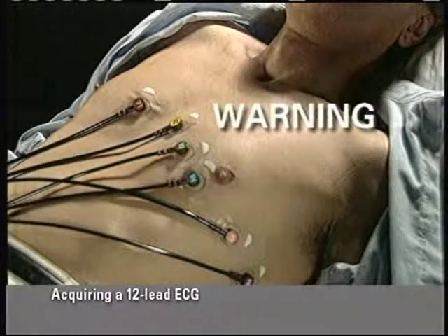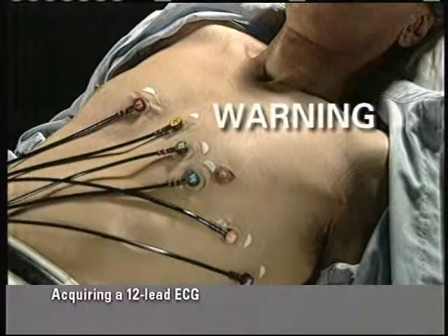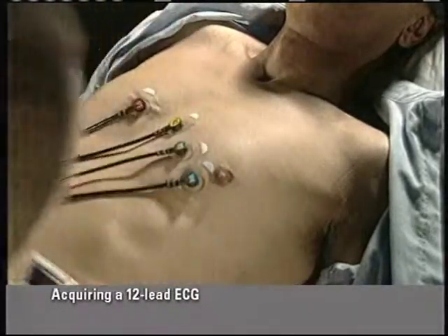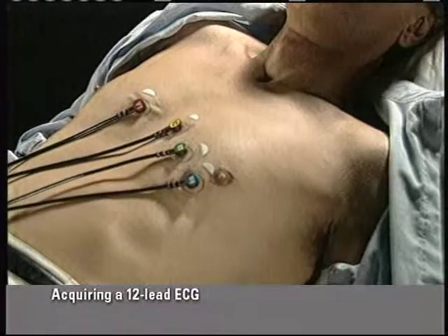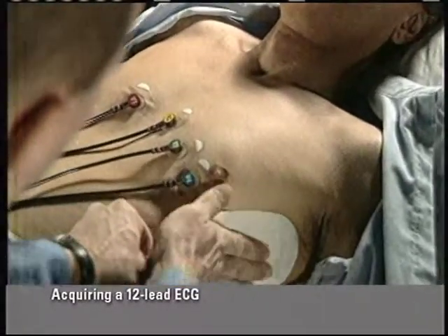Precordial lead electrodes and lead wires can interfere with the placement of standard paddles or therapy electrodes. Before defibrillation, remove any interfering electrodes and lead wires. This concludes the Acquiring a 12-lead ECG section of this video.